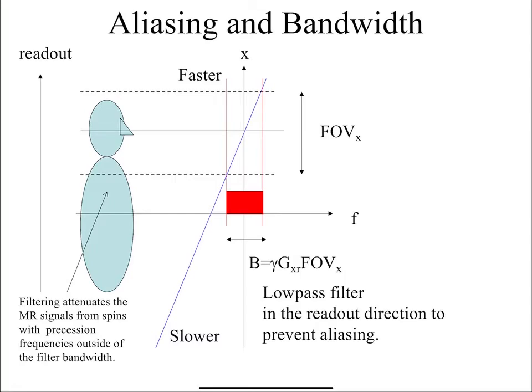The MR signal comes in, it has all these frequencies due to all these spins, but before I sample, I actually apply an electronic filter that just filters out all those other frequencies, such that I'm only left with the frequencies from those spins in the area I care about. So when we do FOV, we've always got this filter on that eliminates those other spins, so that instead of energy from all frequencies, we just capture the frequencies from those spins that we care about.